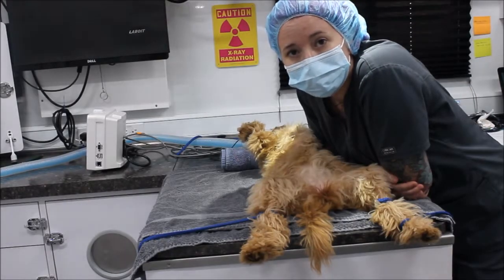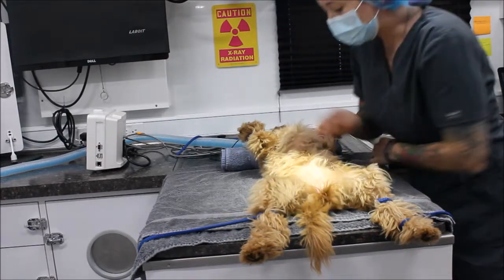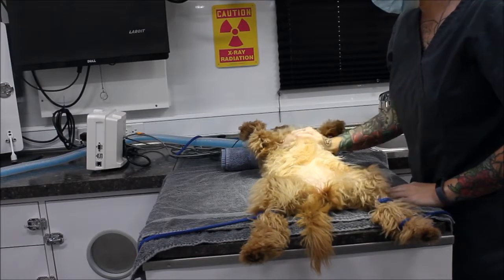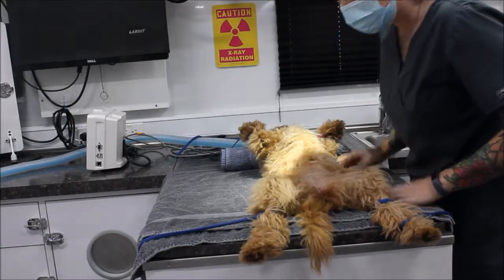In this video, we're going to be preparing a surgical site using aseptic techniques. I have my dog here for ovariohysterectomy — her spay — and the first thing I'm going to do is identify the landmarks.